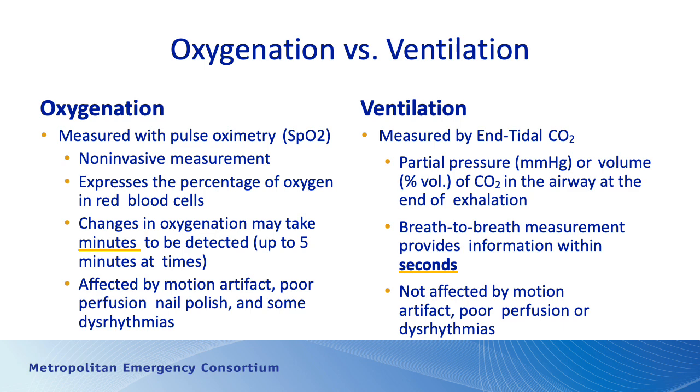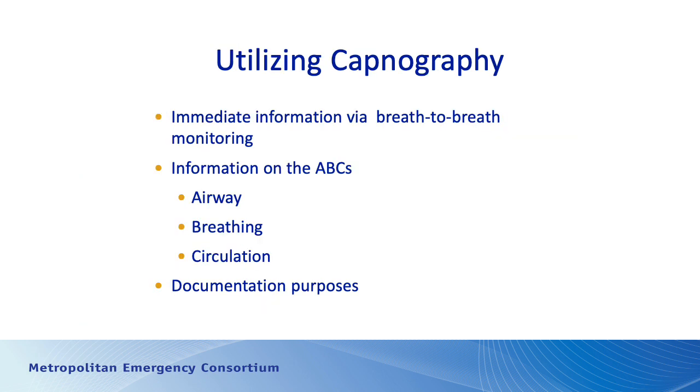And if you see a dysrhythmia that's affecting perfusion, you will see a change in the end tidal CO2, but that's because there's a change in perfusion, not because there is an error or problem with monitoring the carbon dioxide output. So how might we utilize capnography?